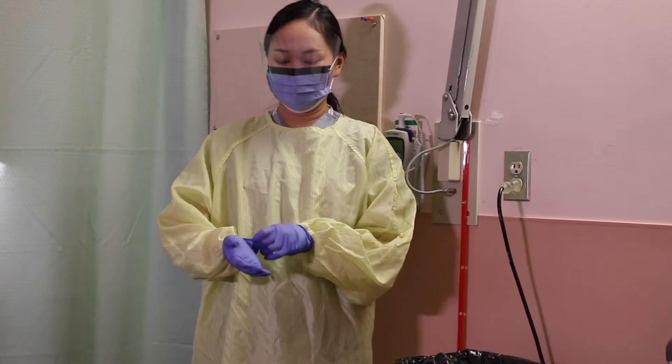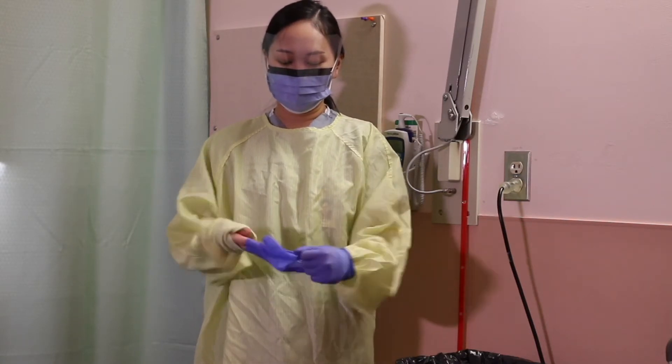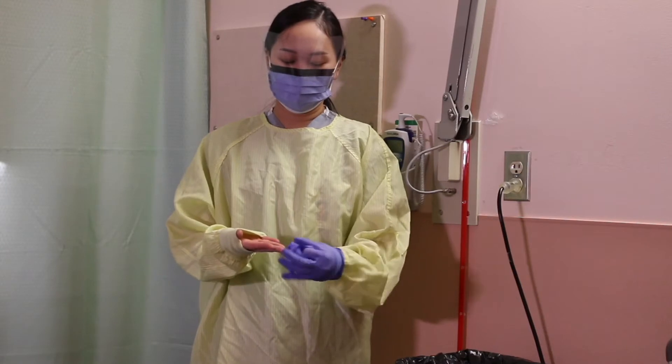Before removing personal protective equipment, make sure you are at least 2 meters away from the patient. Remove PPE in the following order.